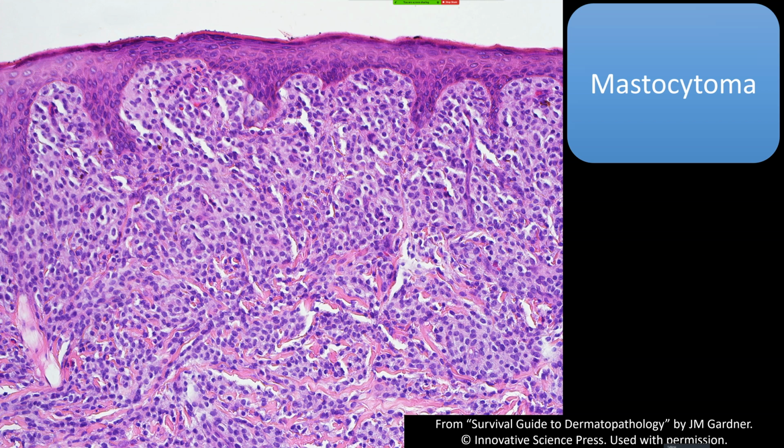Now, in contrast, this is an example of a mastocytoma, or the urticaria pigmentosa form of mastocytosis could look like this. Depends on the clinical, but you can see it's kind of similar. The cytoplasm texture is different, though. These are really a finely granular cytoplasm because of the little mast cell granules that can contain histamine and tryptase.